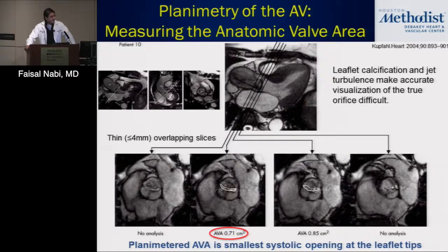So we have to be very careful that we get multiple serial measurements, because as Karla showed you on those TEE images, towards the base the valve area can be very large, whereas the real tightening of the valve is really at the leaflet tips.